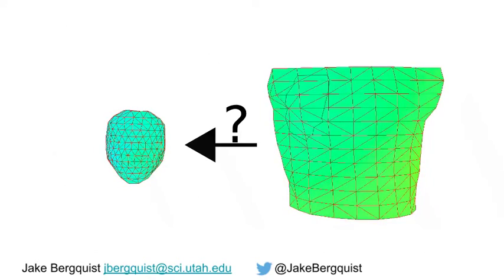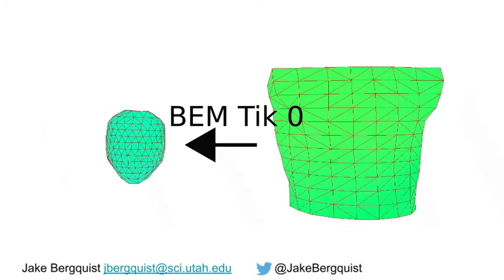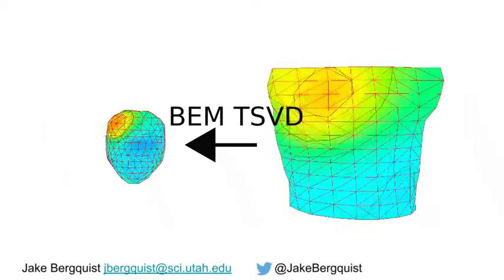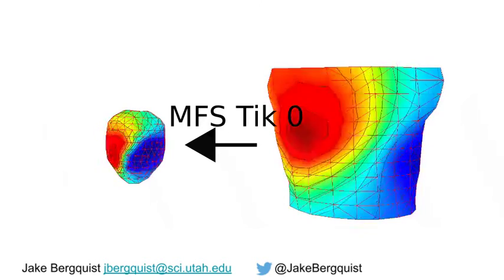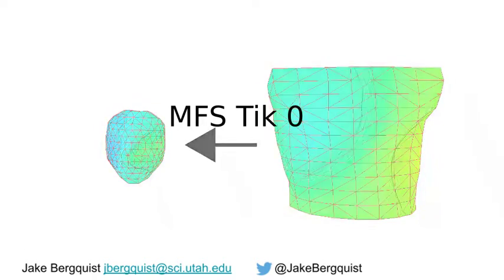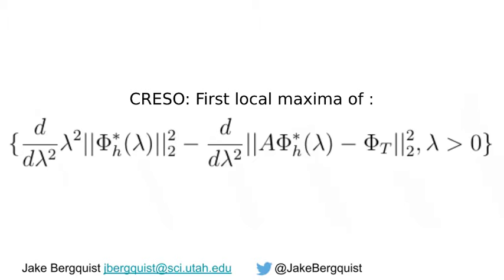We then assessed ECGI reconstruction accuracy using a variety of ECGI formulations. These include boundary element method using either Tikhonov zero order, Tikhonov second order, or truncated singular value decomposition (TSVD) regularization, as well as method of fundamental solutions or MFS with Tikhonov zero order regularization. For each of the boundary element methods, the L-curve was used to select the lambda value. And for the MFS-based method, CRESO was used to select the lambda value.